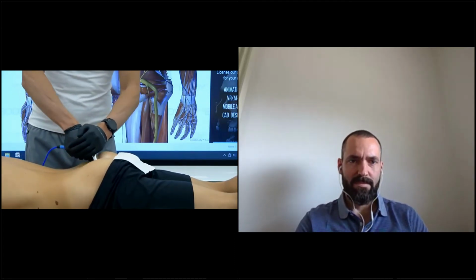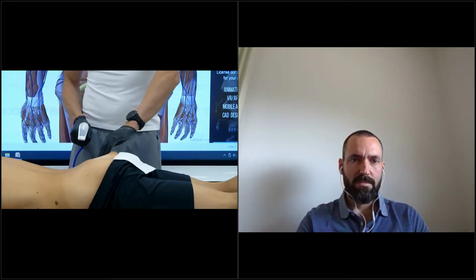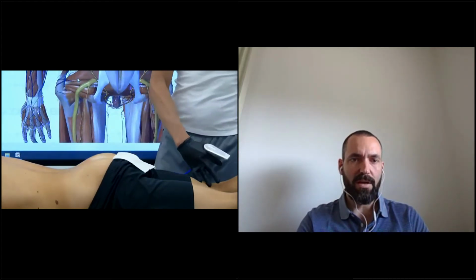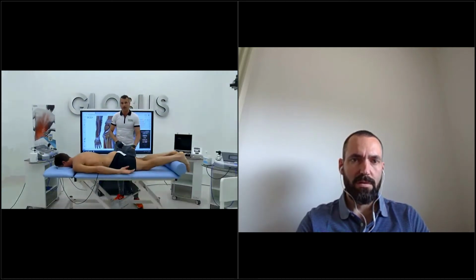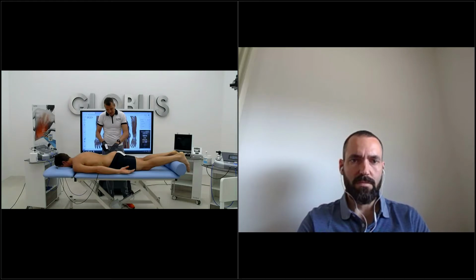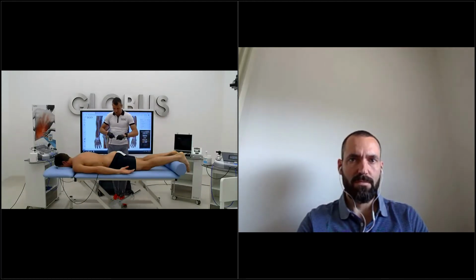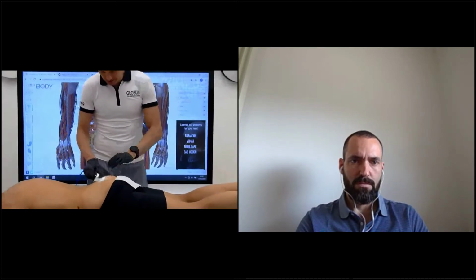All right, it's a good idea. With this patient here, Damiano, the proximal part is more involved, so I decided to shorten the muscle with the bend position, abduction, and external rotation of the leg. In this way the muscle is in a shortened position, and I can reach the deepness and go a little bit under the sacrum. I can also use the Dia blade small, the other one that I use a lot when I want to do specific work on the fibers, on the insertion of fibers.